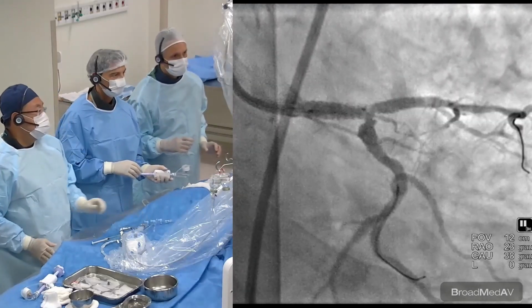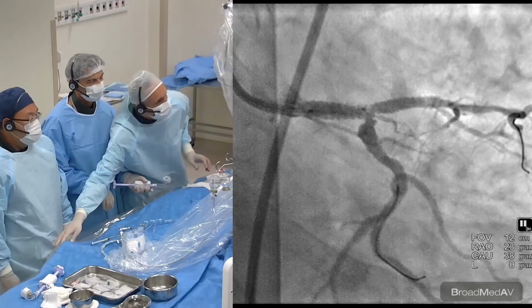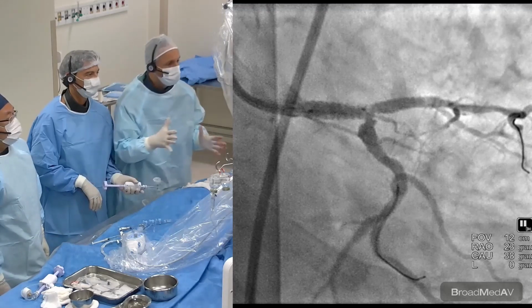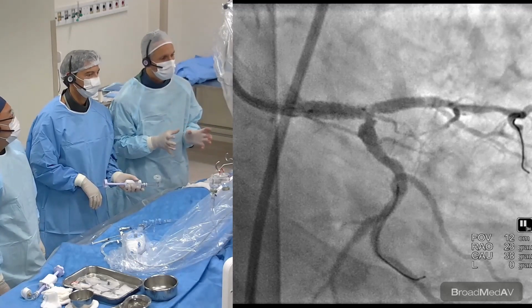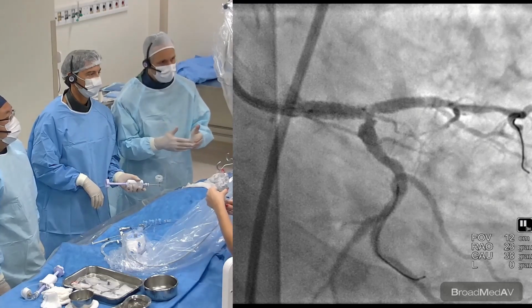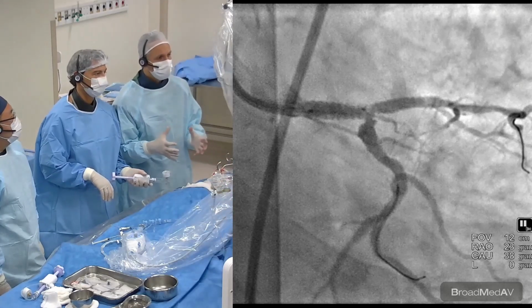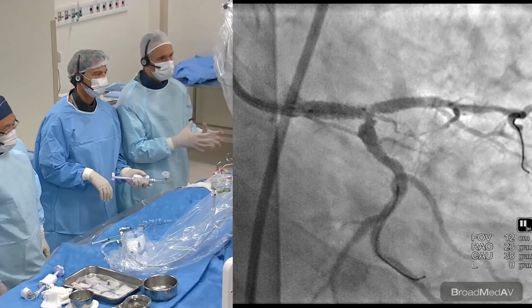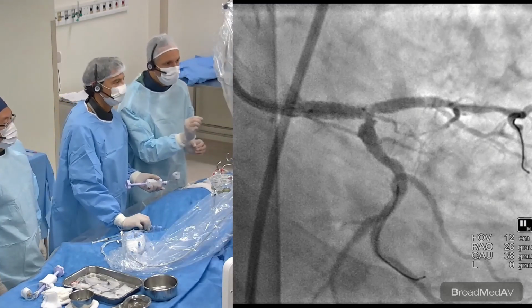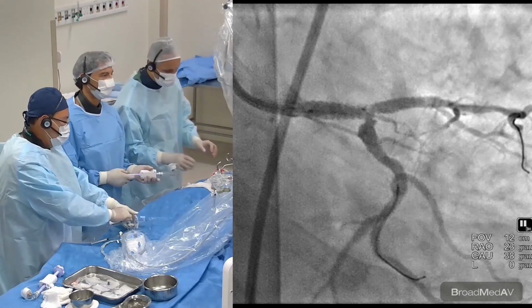Ricardo, could you fix again and explain to the people why you choose this position? Yeah, so here we want to make sure that we are going all the way in the carina, because the proximal part of the bifurcation connects to the distal vessels, which are the LAD and the circumflex. So up to the level of the flow divider, we call this the carina region, you need to optimize according to the proximal diameter of the bifurcation, which is 4.5. I think we still need to go a little bit more distal to really be at the level of the flow divider, okay? So we did this first.